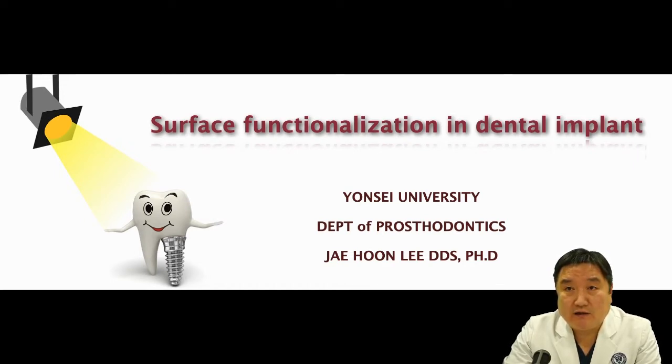Some of you here today may never have heard that implants get old, just like human beings. I know it is a very difficult concept, but it is getting old. Implant surface is getting old. The implant surface is losing its viability and biological activity as time goes by, and we call that biological aging in implants. So today, I'm going to talk about what the biological aging of titanium implants is and how we can overcome this problem by using surface functionalization.